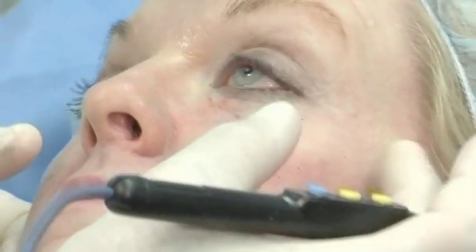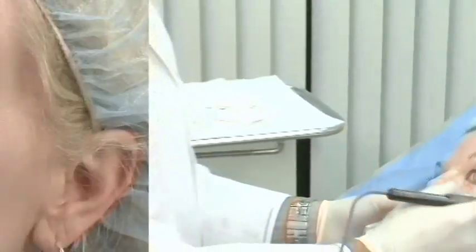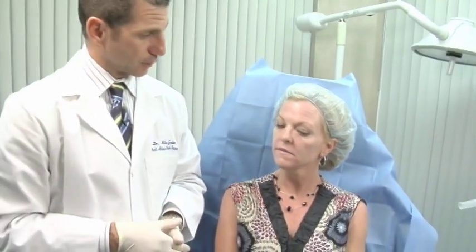Let me take a look. I think we took care of these very nicely — besides the numbing, the lidocaine injection, I think it's very easy to tolerate. After a day or so, she'll be able to put a little bit of light makeup on there. We're going to put a little bit of antibiotic ointment on there for a day, and those will re-epithelialize very quickly. So it's a very effective radiosurgical loop shave of these areas of the lower eyelid, and I think Julia's going to like the results.